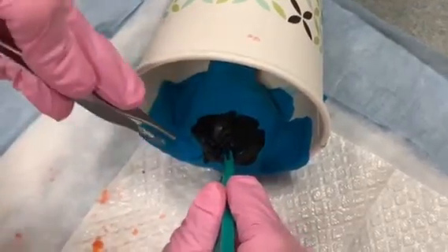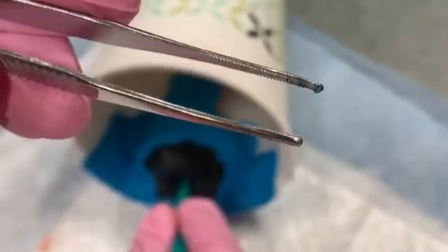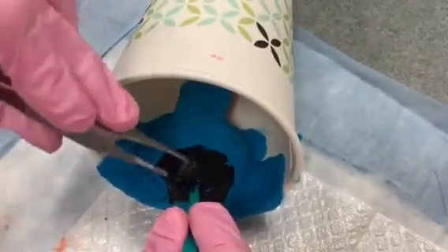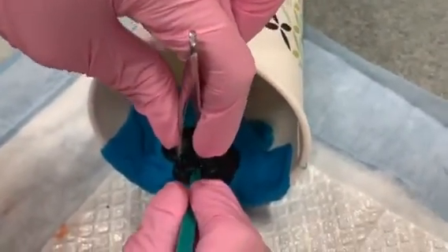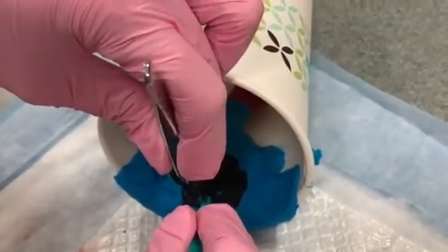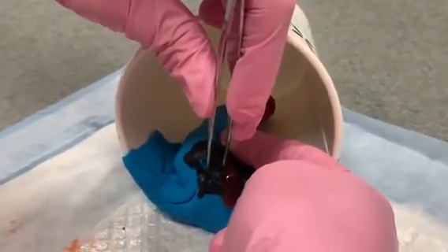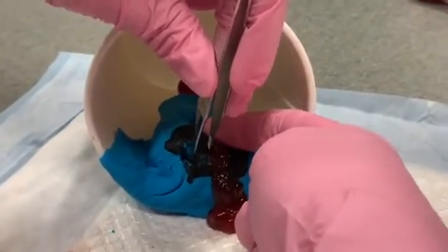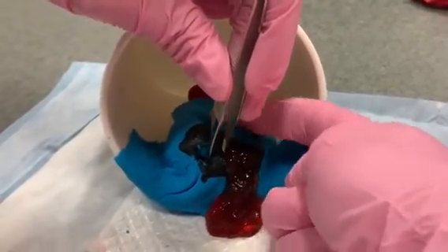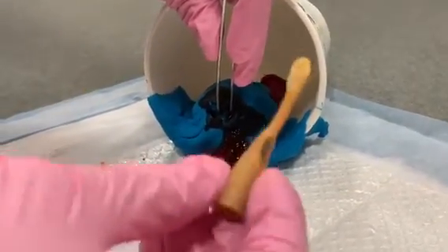Before you take out the scalpel, you want to use your pickups. Typically we'll use tooth pickups, and you want to grasp the skin and the cyst wall before you remove the blade. You can express some of the contents of the abscess, but you don't want to express all of it completely, otherwise you may lose the placement for your Word catheter.